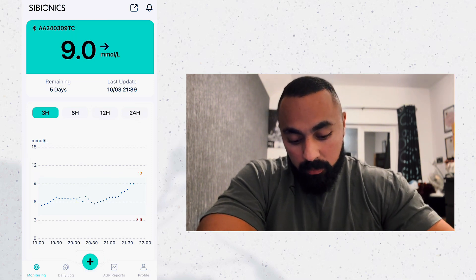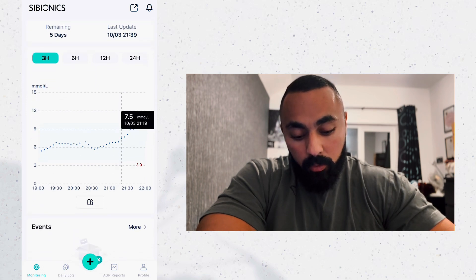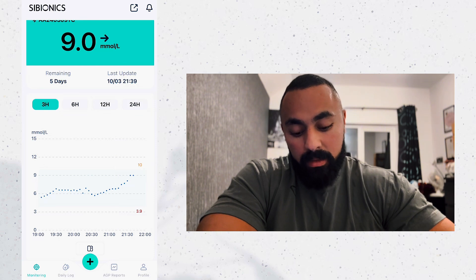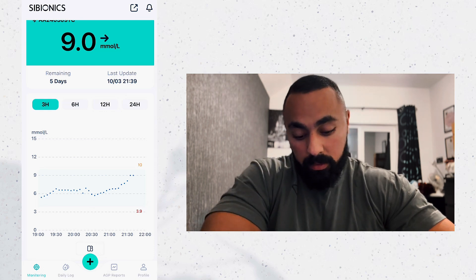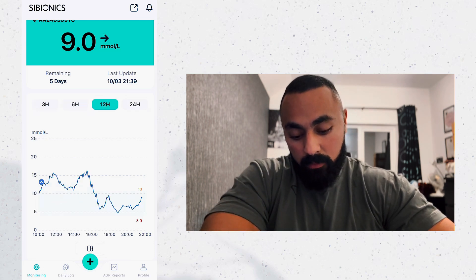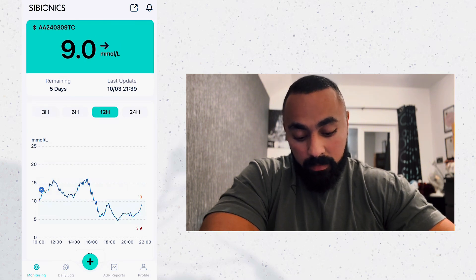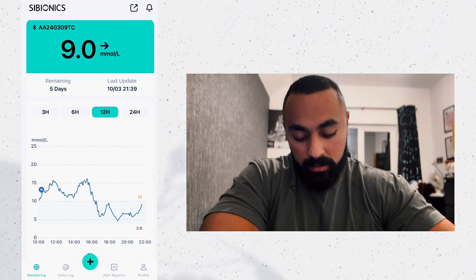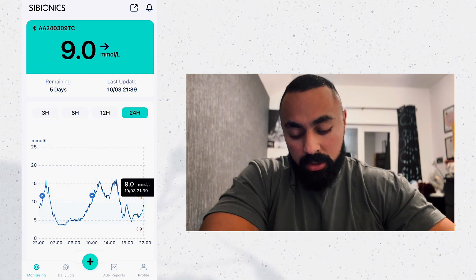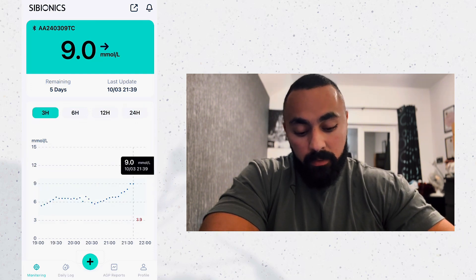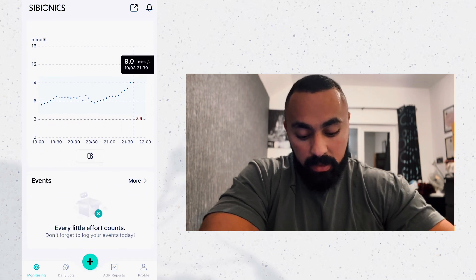Let's go through the first page — the monitoring section. It shows you monitoring of the whole day up to 24 hours, but you can split it. Right now on screen it's showing the past three hours only. You can switch to six, twelve, or twenty-four hours. As I said, I've been very ill lately and become very insulin resistant, which is why my blood sugar is all over the place. On this home page you've got your blood sugar, days remaining, last update, and the time frames. When you scroll down you've got the events — I have no events.